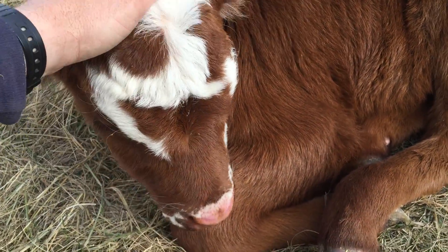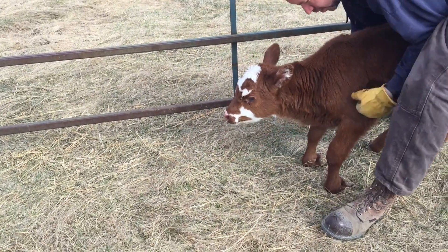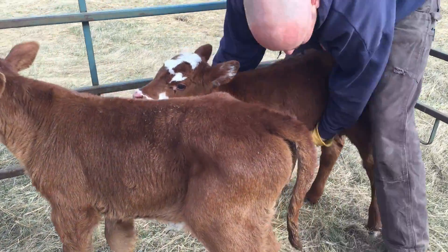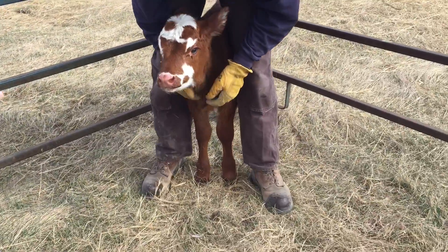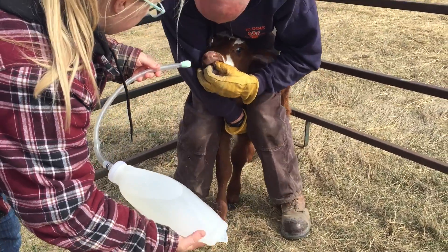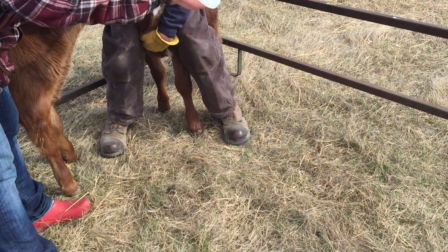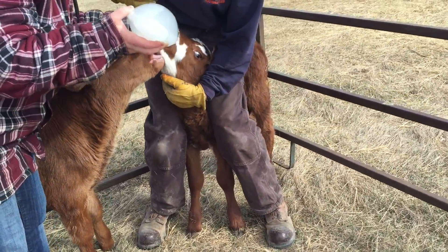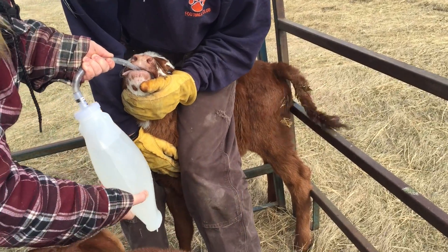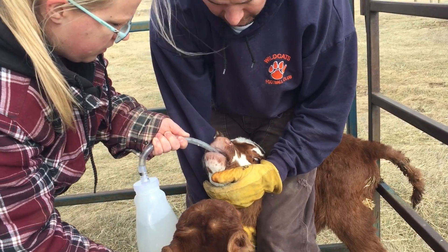Let's do this little girl. It's a lot easier if you have two people doing this. It's nice to get them into a corner — it's easier to contain them that way. Open up. She's sucking it in now and that'll help get the tube going the right direction. You don't want to just force it and jam it down — you want them to kind of help suck and bring it down on their own.